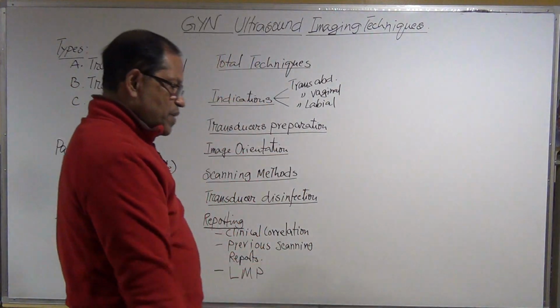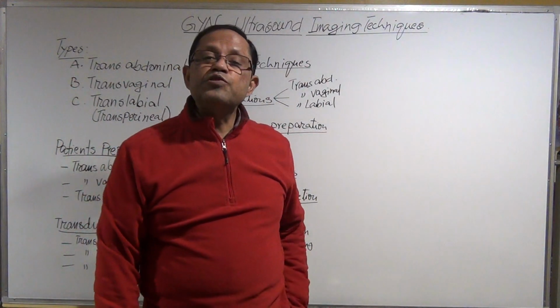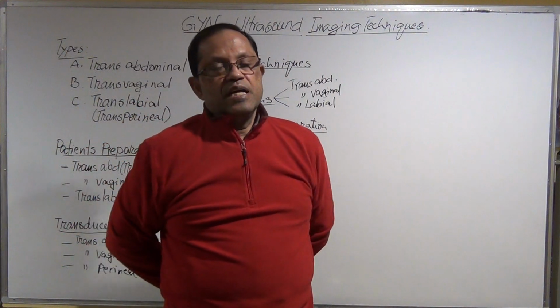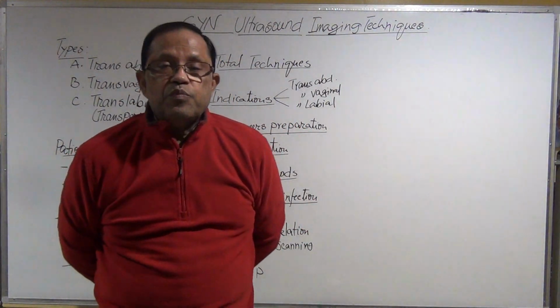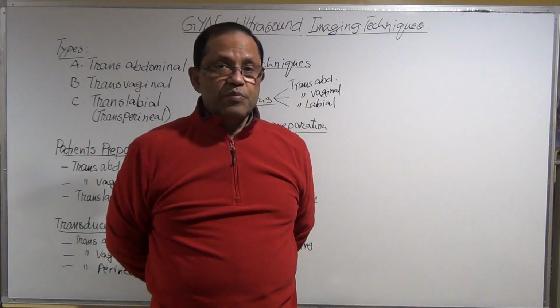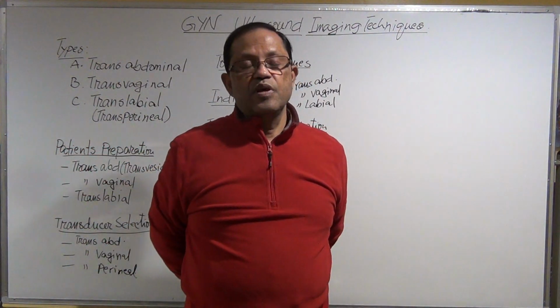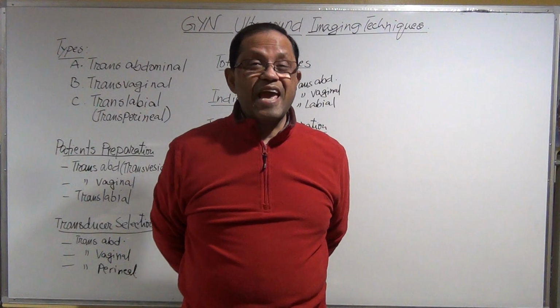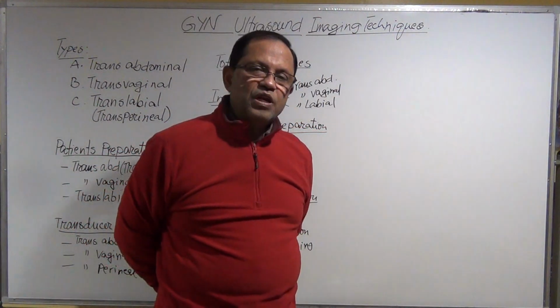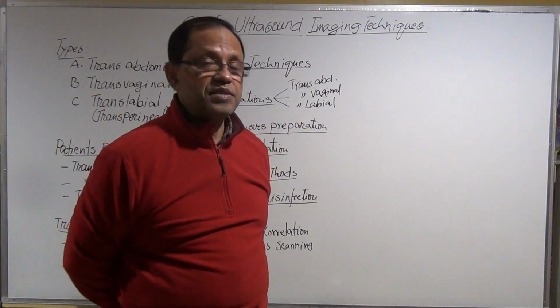Okay, so now I was talking about the full bladder. The full bladder also works so that you can visualize the posterior wall of the bladder. Is there any indentation? Because some fibroids, subserous fibroid or pedunculated fibroid, can make an indentation onto the posterior wall of the bladder. You can notice it and identify the pathology.